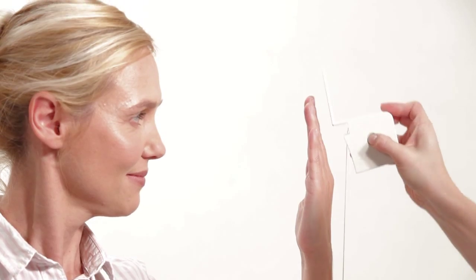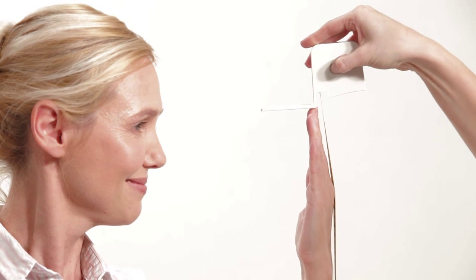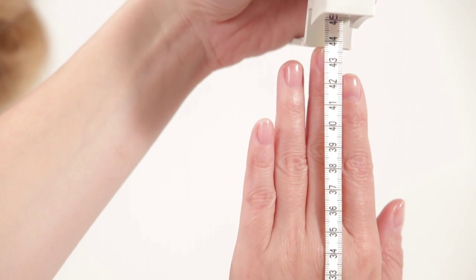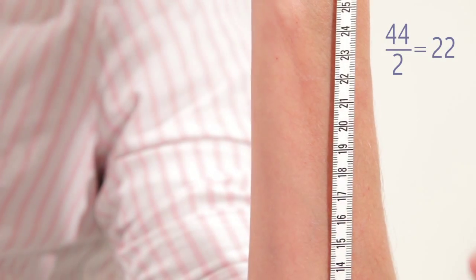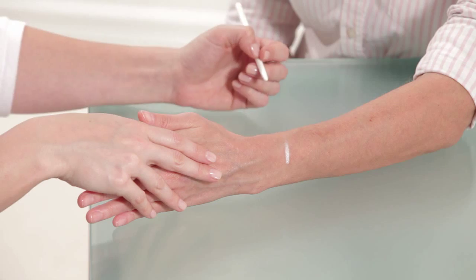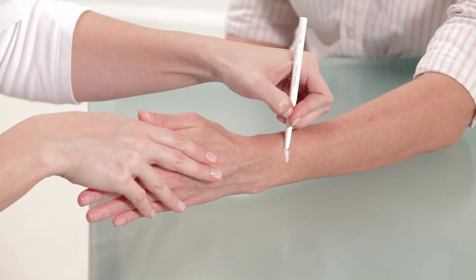While measuring, make sure that the gauge's platform is on the desk and the subject's fingers are straight and extended. Measure the distance between the gauge platform and the tip of the third finger. At the halfway point, draw a mark. Extend the mark to make a line across the surface of the radius, covering half the diameter of the arm.